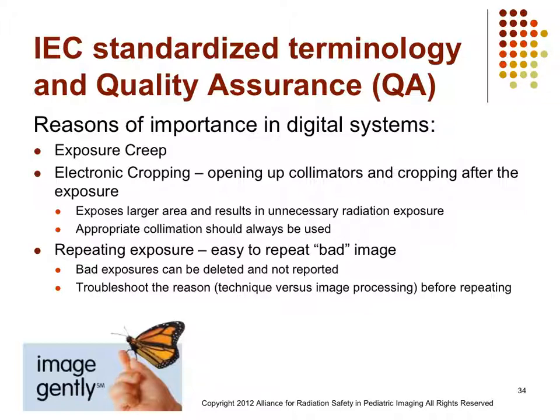So you'll have a good understanding of how that really can be a detriment to facilities, because as we increase our technique, that visual appearance becomes better and better and better. But it's not just about the visual appearance, it's about an acceptable appearance for a radiologist to make a diagnosis. So we have to make sure that we're using radiation responsibly in that nature.